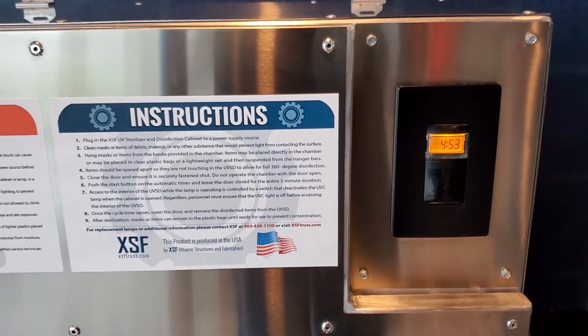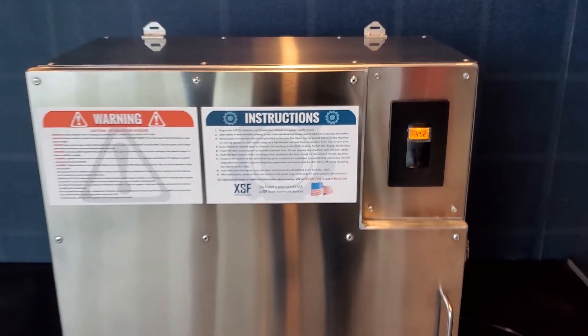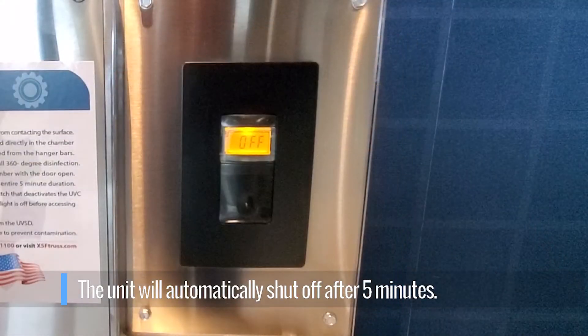After 5 minutes, once the timer reaches zero, the UVSD unit will automatically shut off.